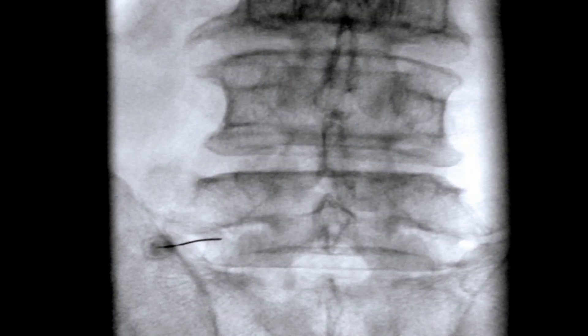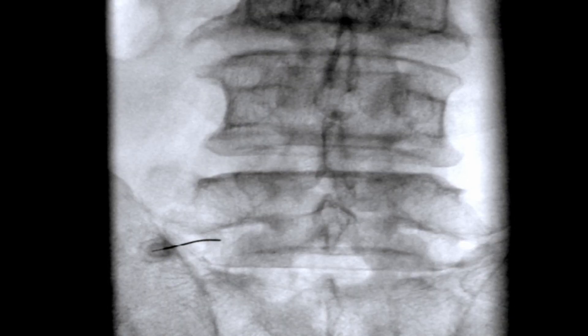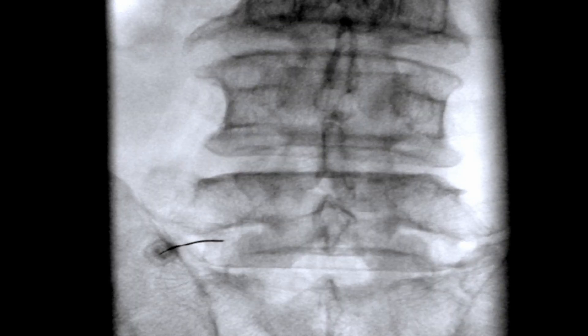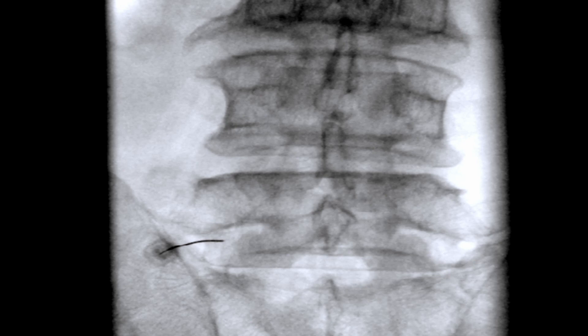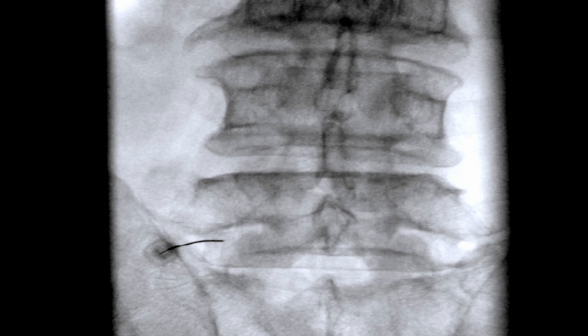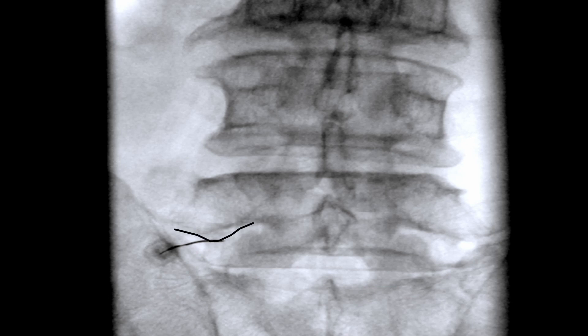Our upcoming patient scenario introduces a distinct set of challenges. Due to a high iliac crest and a lower transverse process, a steep AP needle advancement and an inferior direction in needle progression are unavoidable. When examining the AP view, the small superior articular process would allow straightforward insertion into the subpedicular 6 o'clock position. However, the insertion window in this instance was obstructed by a non-visible structure, often the transverse process.